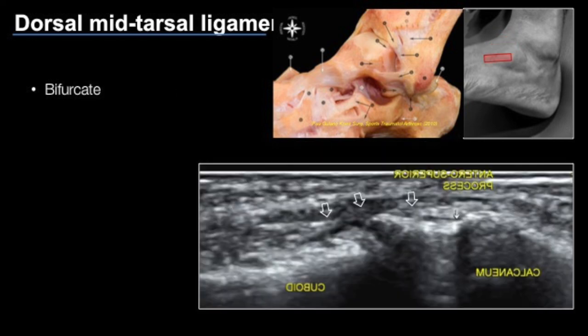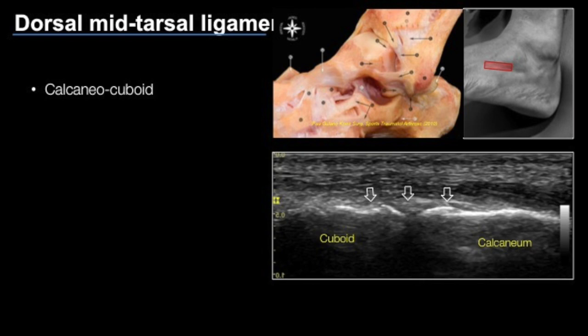For the bifurcate ligament, we identify the anterior superior process of the calcaneum and the ligament appears as an echogenic cord-like structure. The calcaneo-cuboid ligament has a similar appearance and is assessed by connecting the cuboid and the calcaneum.